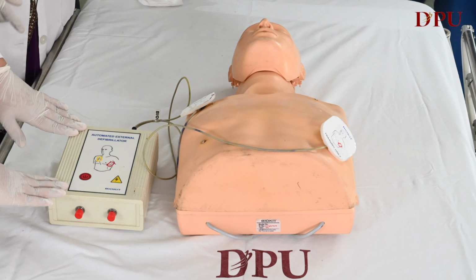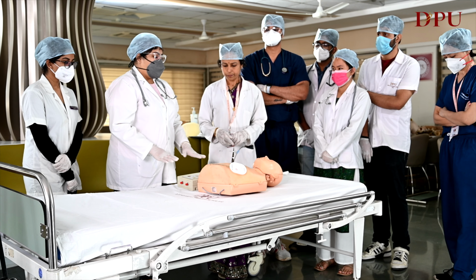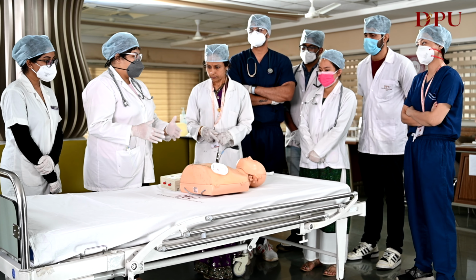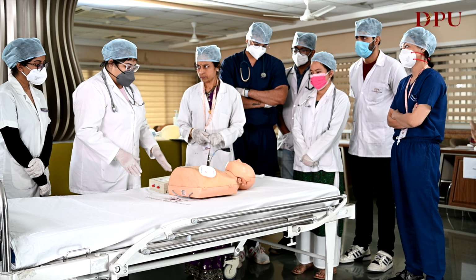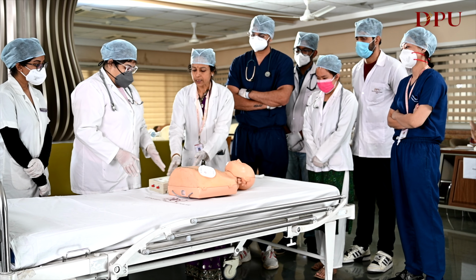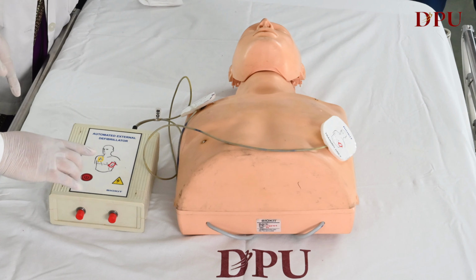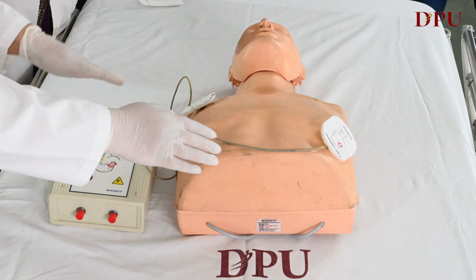This is an automated external defibrillator. When a person has an acute myocardial infarction, in layman's terms a heart attack, what I'll do is I'll ask for this. It has come now. Your person is here. Step one, I'll turn on the power button. So power is on.